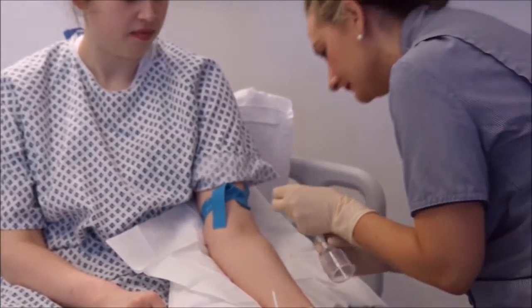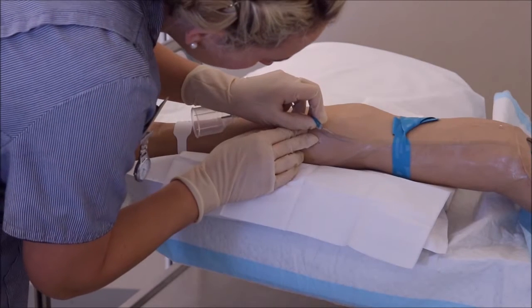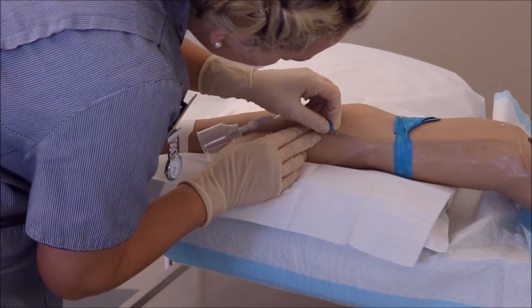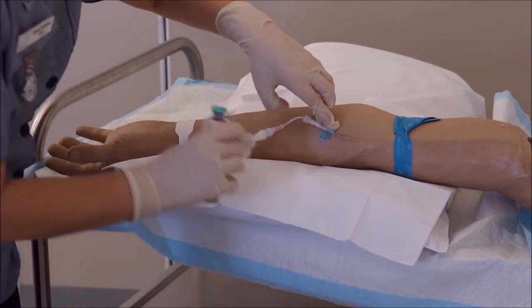Unsheath the butterfly needle. Insert needle bevel up. Check for flashback. Secure one wing of the butterfly in a north-south direction with sterile tape.